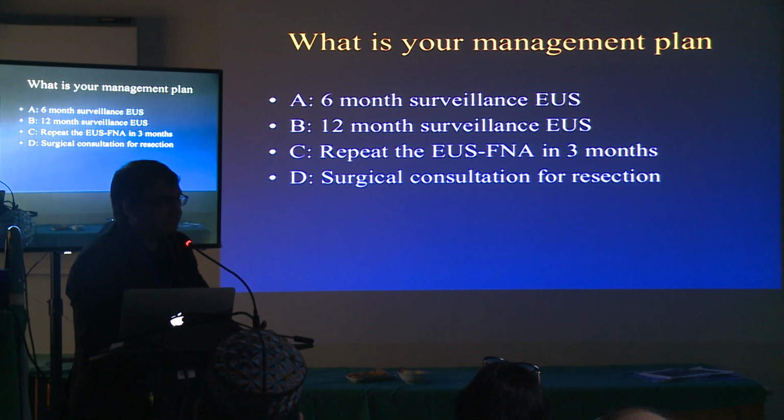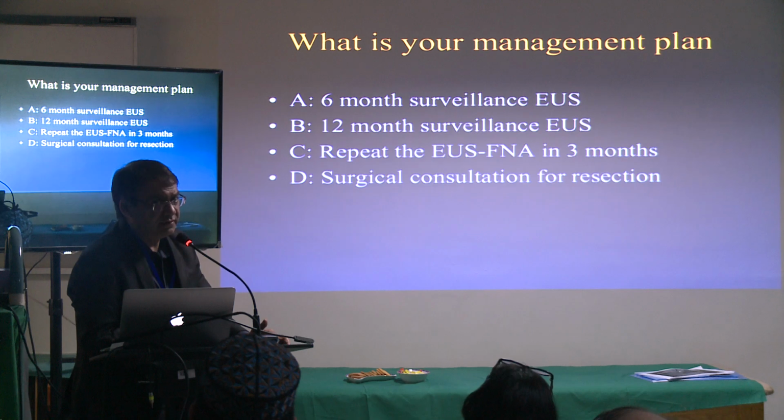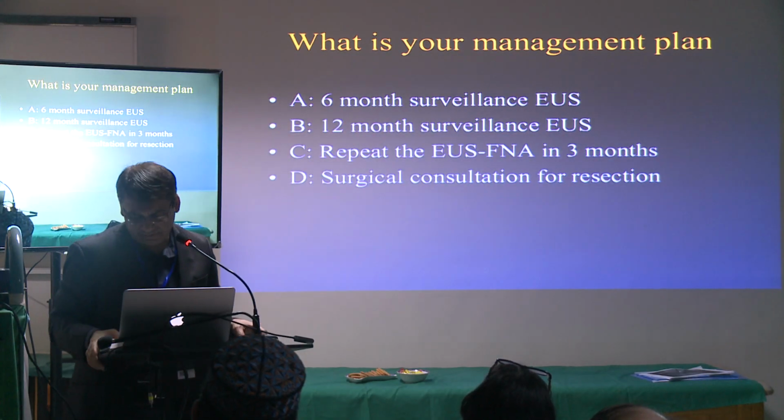Anybody else? Okay, we'll repeat a biopsy. Okay. Okay. And so everybody agrees it's 3 months, okay? We'll get to the answer in a minute, okay?